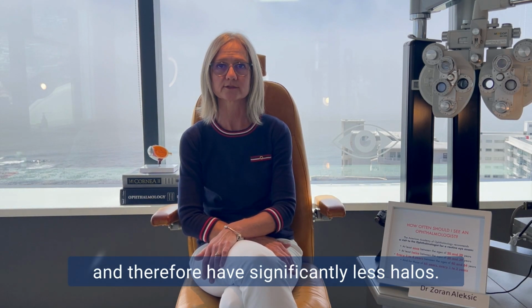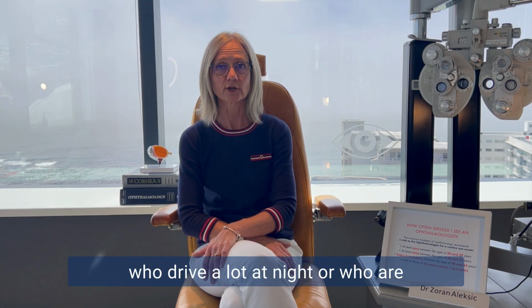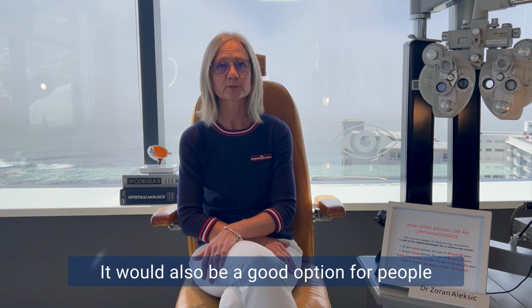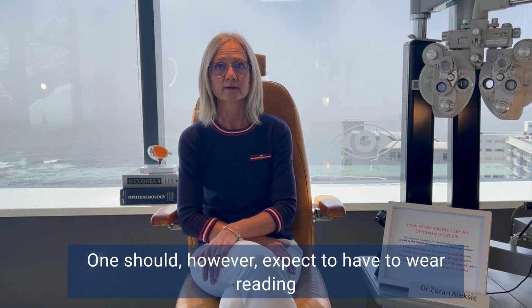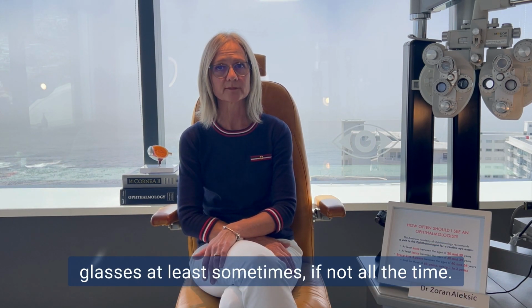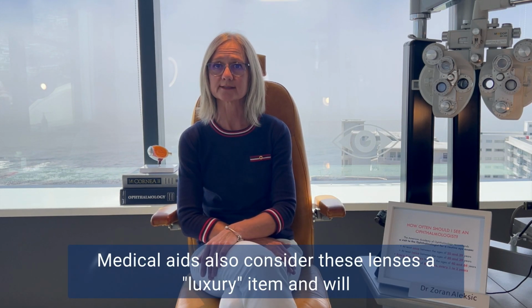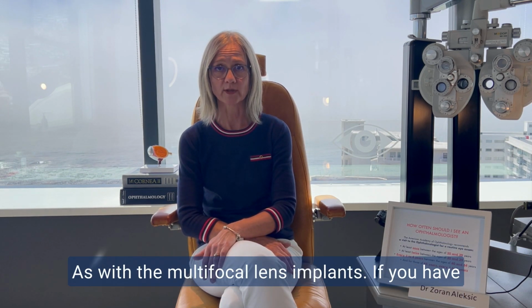The advantage of this lens is that it does not have the concentric circles and therefore has significantly less halos. This would therefore be a good option for people who drive a lot at night or who are worried about how the halos will affect them. It would also be a good option for people who are used to monovision with contact lenses. One should, however, expect to have to wear reading glasses at least sometimes, if not all the time. Medical aids also consider these lenses a luxury item and will also not cover the cost of the lenses in full, as with the multifocal lens implants.